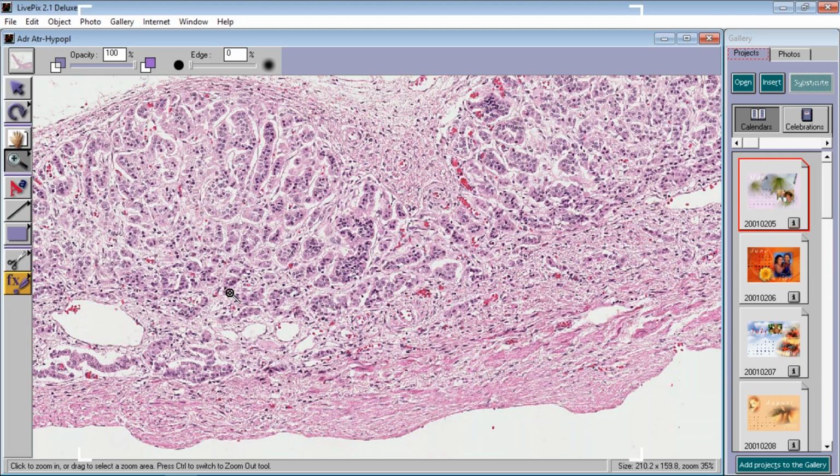Now see, I got news for you. The slide was labeled as adrenal cortical atrophy, but technically hypoplasia is a better word because atrophy refers to, perhaps, smaller cells. This is actually normal cells, but a decreased number. So this is an adrenal in which you see there's only maybe 20 or 30 cells in it as the cortical thickness. So this is adrenal cortical hypoplasia.